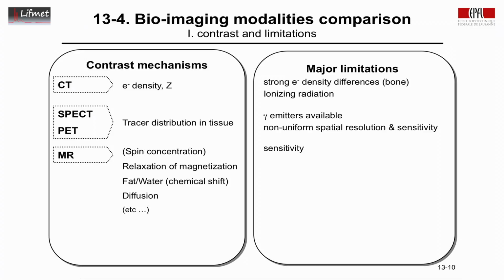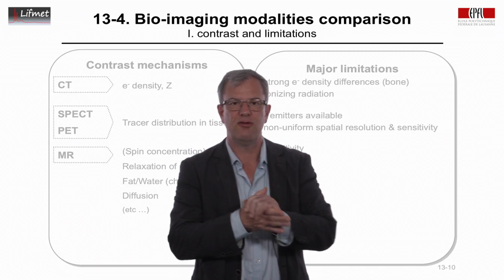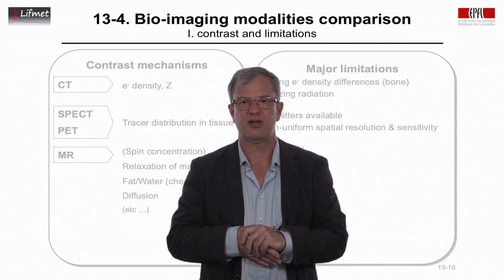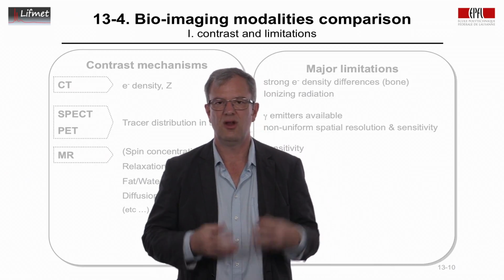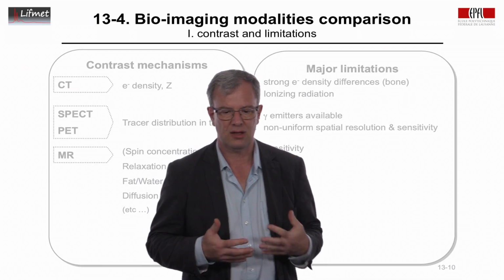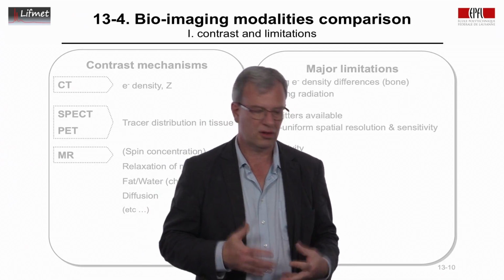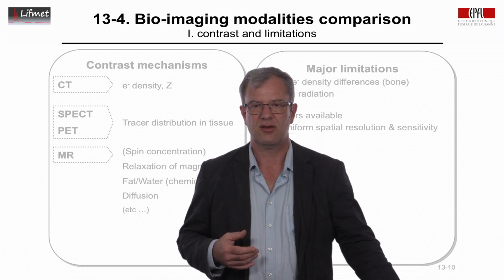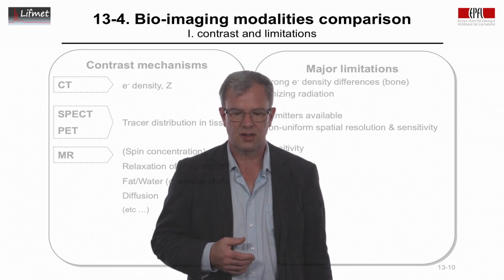The limitation of magnetic resonance is its sensitivity. While we can imagine imaging a few picomolar of positron emitters in the body, a few picomolar of spins is not going to give us a measurable signal. We're stuck here with a low sensitivity technique. This is compensated by using the signal of water with the Boltzmann distribution. This gives, however, then again a strong signal.